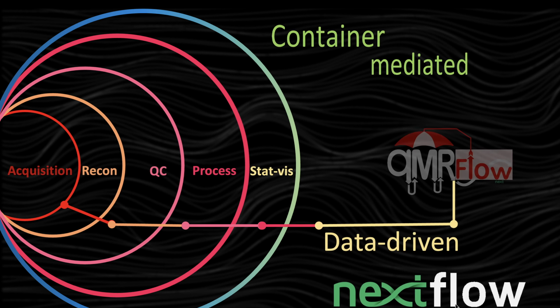So his work focuses on what he calls qMRFlow, so it's container-mediated and data-driven pipelines using the Nextflow software or framework.